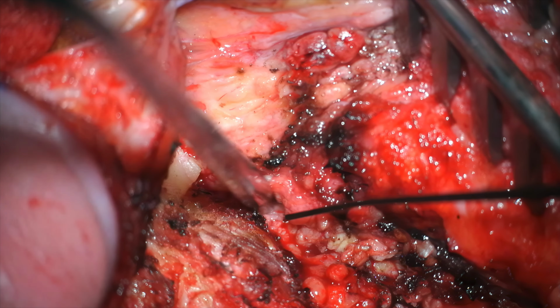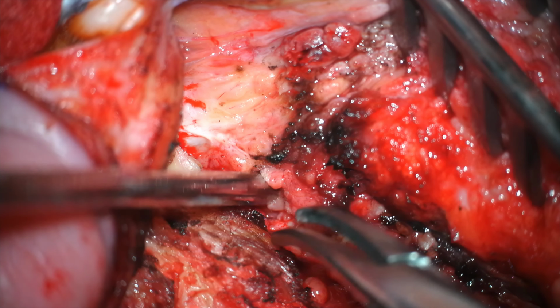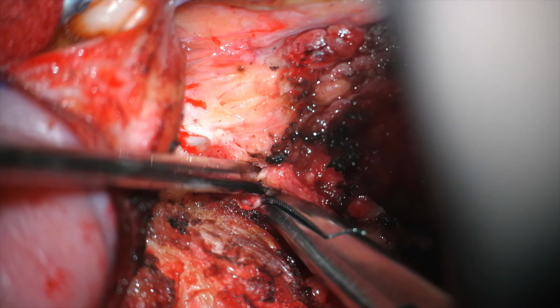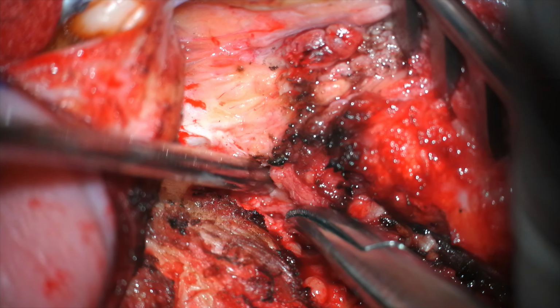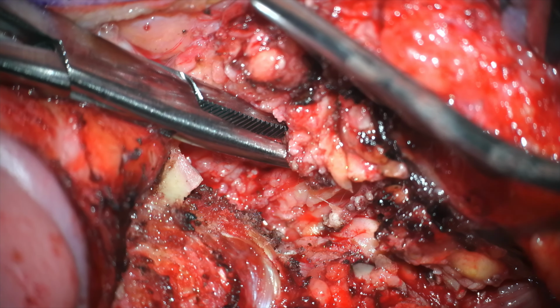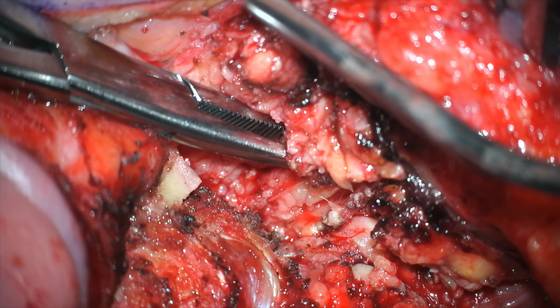So now you have to expose that a little better. Get it there. Okay? Pretty close. Yeah, so just spread the tissue over it, and you want to expose that. That's good. There. Okay, good. Now, see that depth? You're at 0.3 right now. Yes, you're at 0.3. So see that depth. So I need to take this thing out, right there. Go ahead. Okay. Right there.